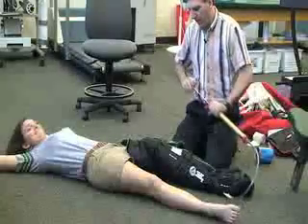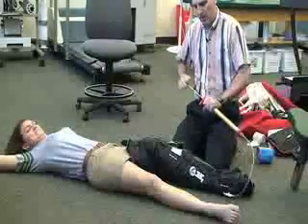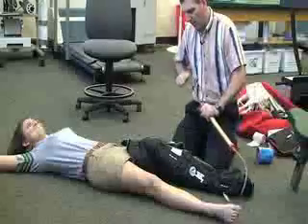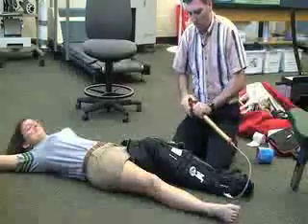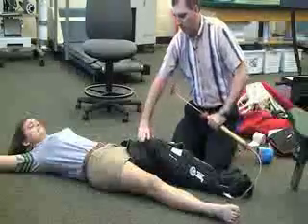Tell the patient that the splint is going to harden up on them. You don't want it to be too tight, but you do want it to apply some support for a rigid splint.